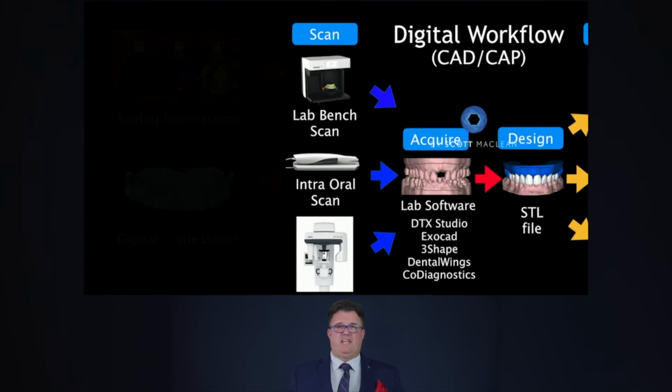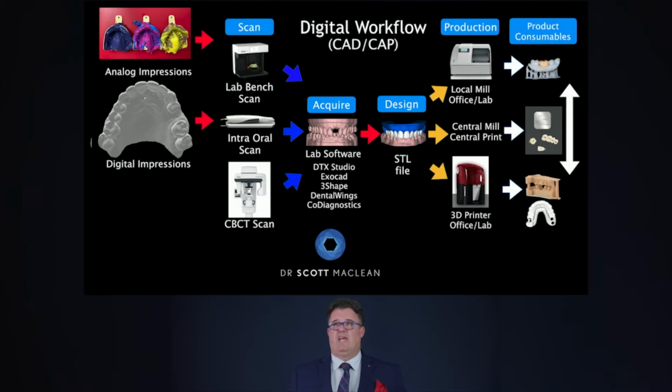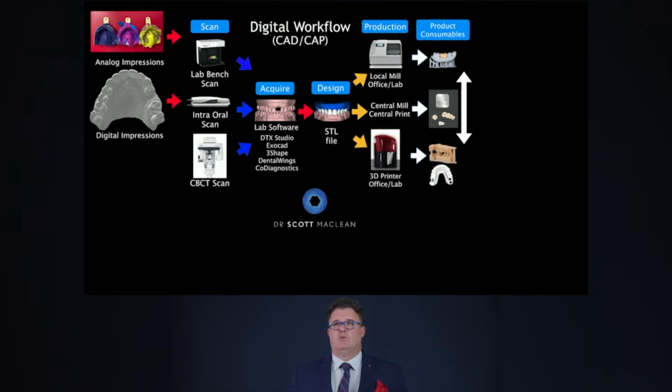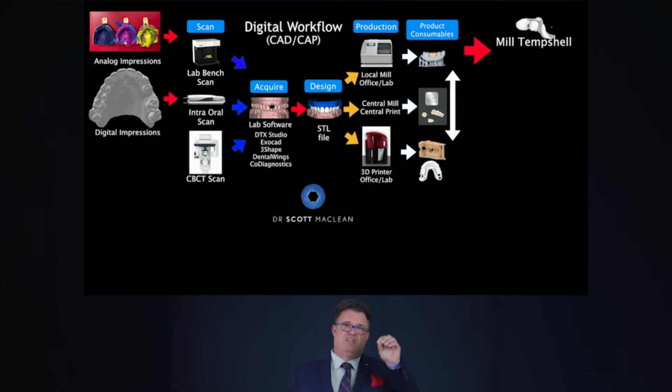So we've got all the data in at the lab or in your office or where this is going to happen. Now, what are we going to do with that? Our goal is to make things that we're going to use to treat our patients. We could, for instance, make a temp shell, a form of temporary that can be made exactly to fit on your implant after you place the implant. It's designed on your computer after you've placed the implant, and you can then choose to mill it. It has to be milled because it's a product that needs to stay in the mouth a long time, so at this point, you can't print these.